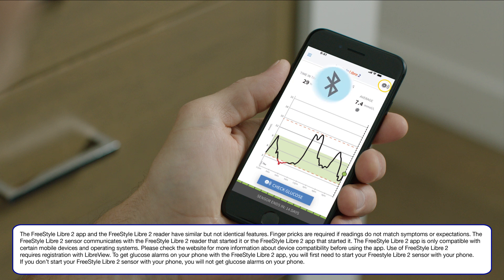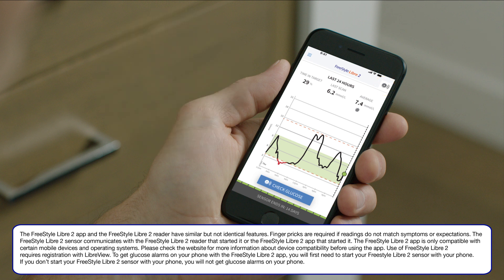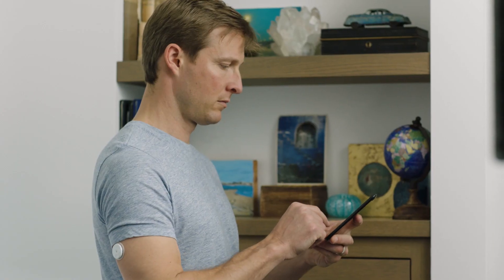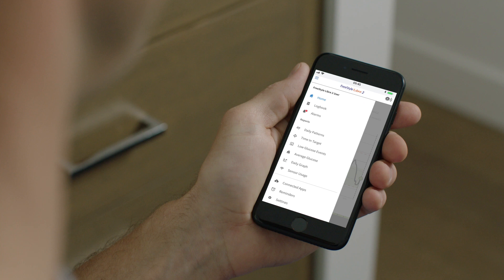Be sure to turn on Bluetooth before starting a new Freestyle Libre 2 sensor. When your phone and your sensor are within 6 meters unobstructed, they will automatically communicate to give you low and high glucose alarms if you have turned alarms on.